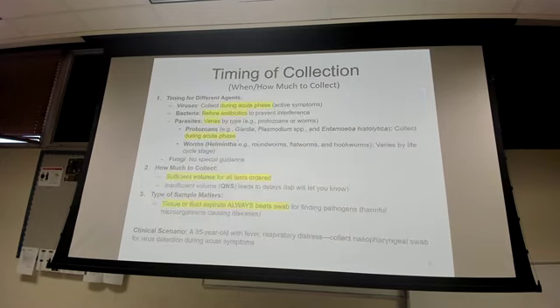Timing of collection. This is also an important slide. Viruses are collected during the acute phase, so when they're having active symptoms, that's when you want to collect. For bacteria, it is imperative that you collect whatever it is, CSF, fluid, blood, feces, prior to giving them any medication. Parasites may vary, and for fungals it says no special guidance, but each MTF or each lab will have its own specific guidance.